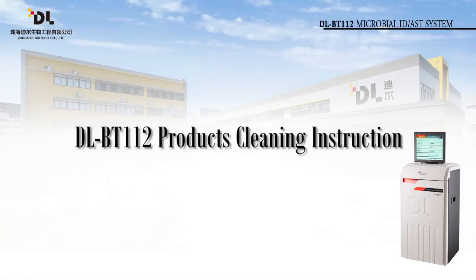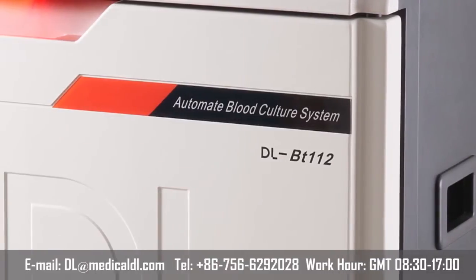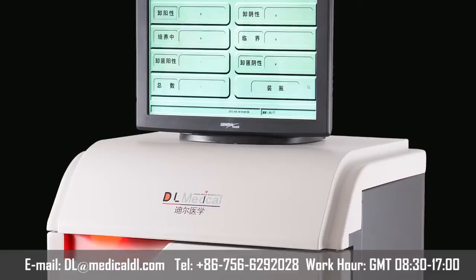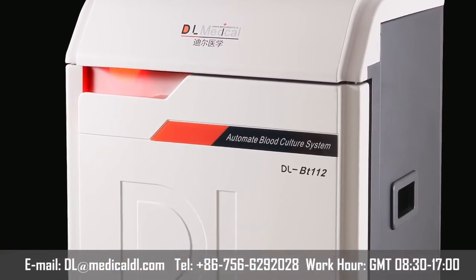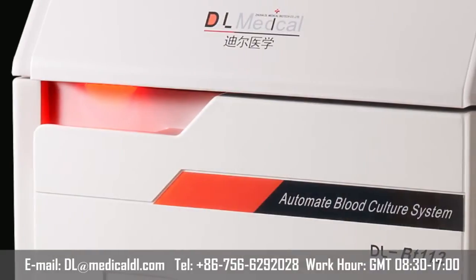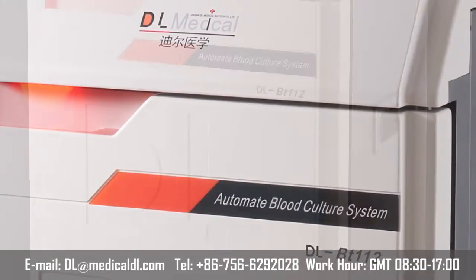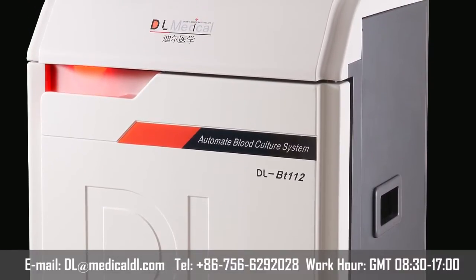Section 5: DLBT112 product cleaning instruction. If specimen spillage occurs, disinfect the affected instrument surface using disinfectant containing 5% chlorine diluted 20 times. Let the surface and bleach liquid fuse for 15 to 30 minutes, then wipe with a wet towel and finally dry with a clean towel.